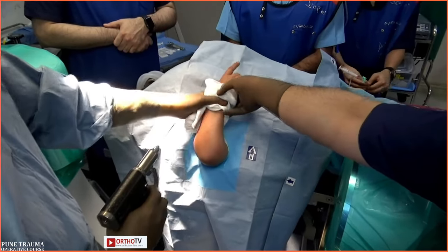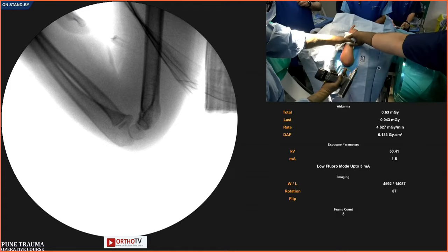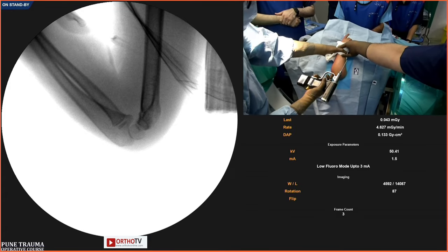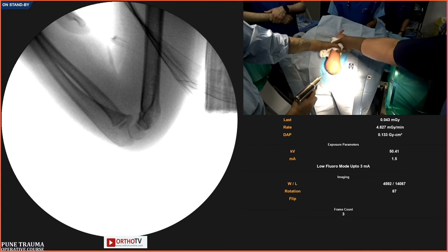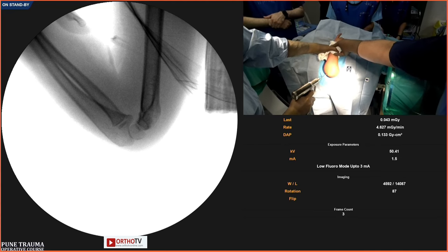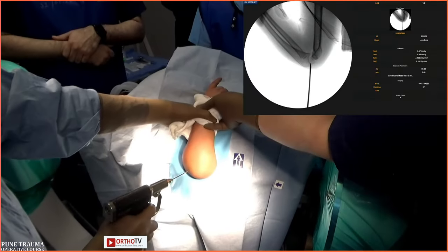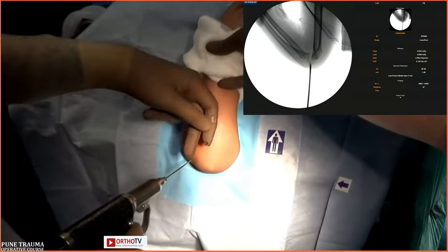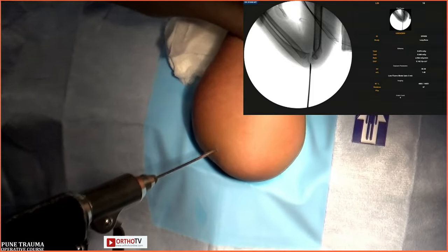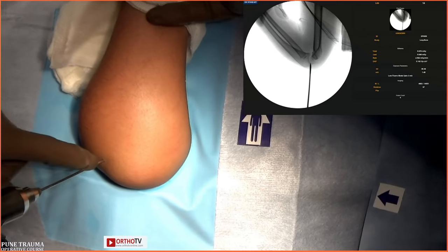Can we see the C-arm show, Peter? Yeah, show the C-arm. Okay, so again, I'll show you here. This is the tip of the olecranon. This is the lateral epicondyle. About a centimeter and a half away, I put my pin first on the lateral side. We want to see the clinical picture. Sandeep, please repeat what is the entry point. I feel the tip of the olecranon and about a finger and a half, 1.5 centimeters away, I will put my pin percutaneously on the lateral condyle.